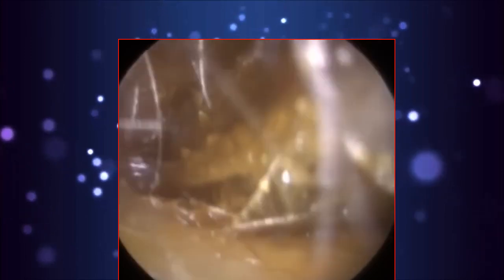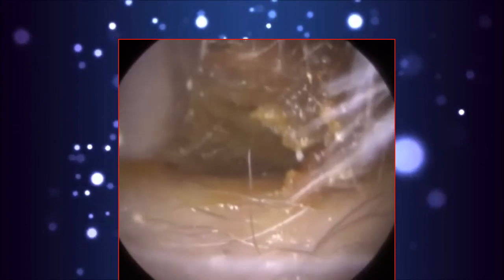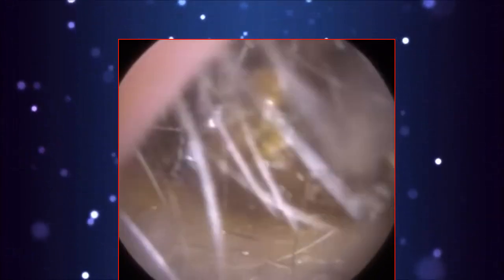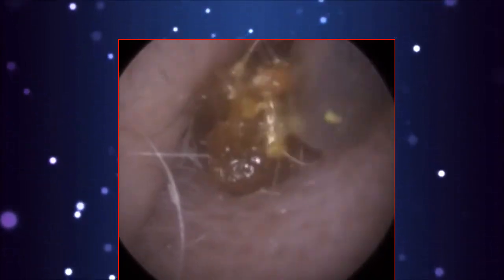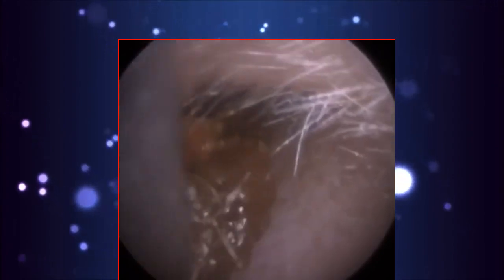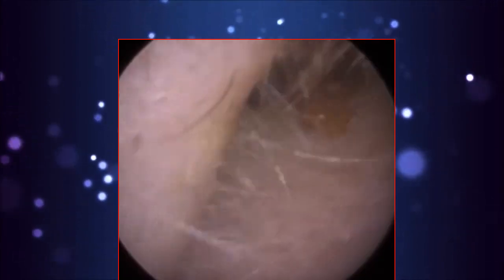It's fallen upon itself. So the back part of the ear canal, the cartilaginous portion just at the entrance, possibly due to age, it's just drooped over, which has almost concealed the entrance of the ear canal. It's made it a lot narrower and therefore a bit more tricky to remove. That in part could be the reason as to why the patient's developing chronic earwax impaction. This wax is trying to naturally migrate out of the ear, but when it reaches the entrance, because of the canal being slightly collapsed, it's preventing the wax from naturally migrating.